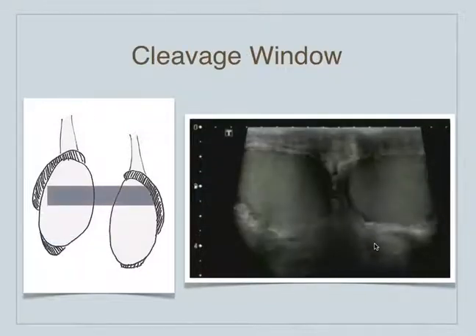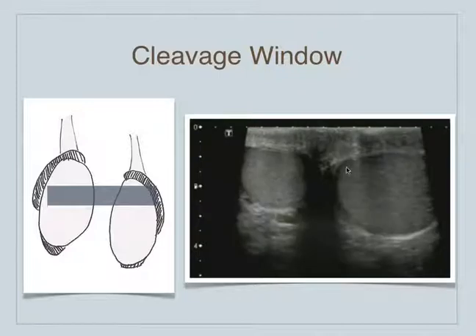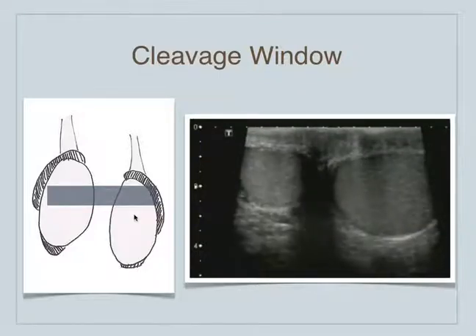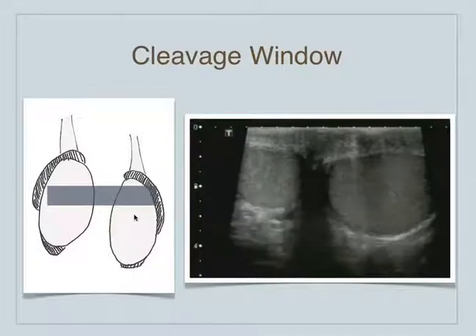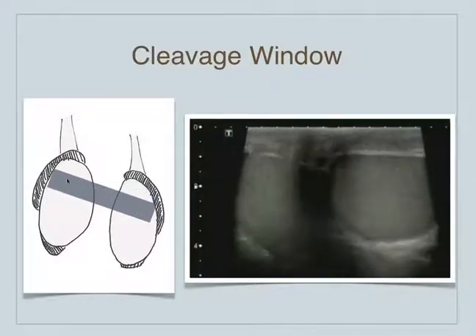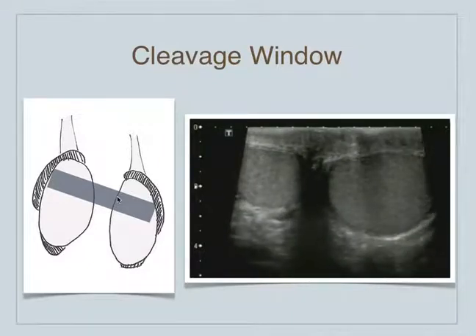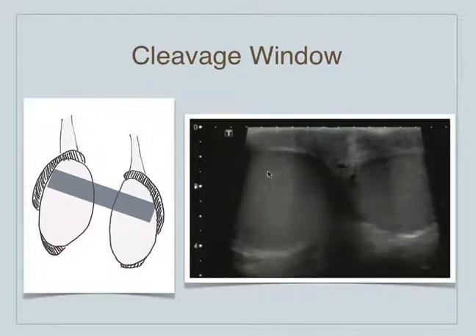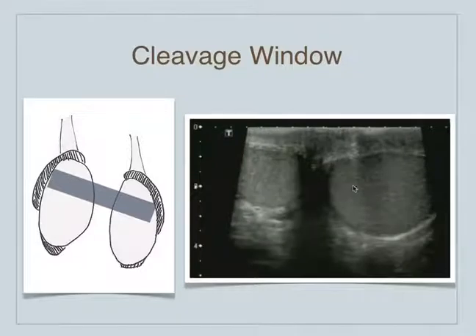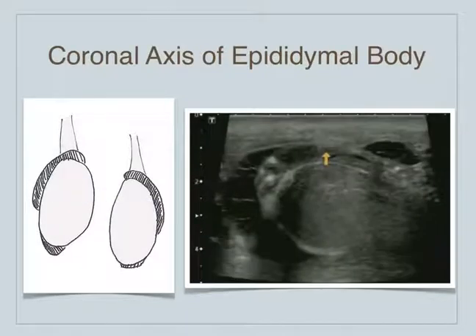There's something called the cleavage window, where we can see both testicles at the same time. Knowing that the left testicle hangs a little lower, we may need to rotate the probe slightly to have a true cleavage window where we see basically the same axis of both testicles simultaneously. We see the right testicle and the left testicle here, and when you can see them both like that, that's the cleavage window — it's a nice view to compare the testicles.